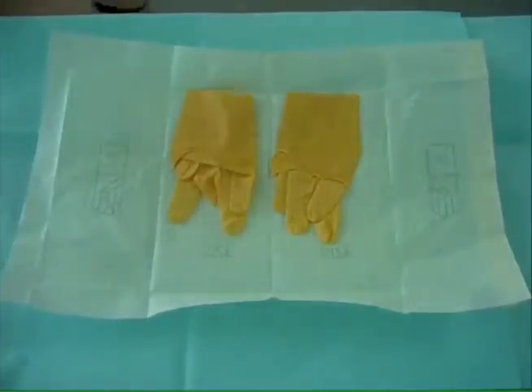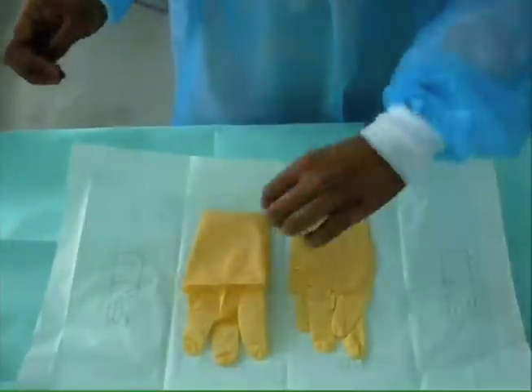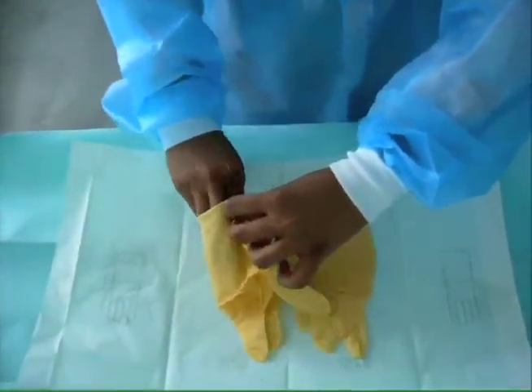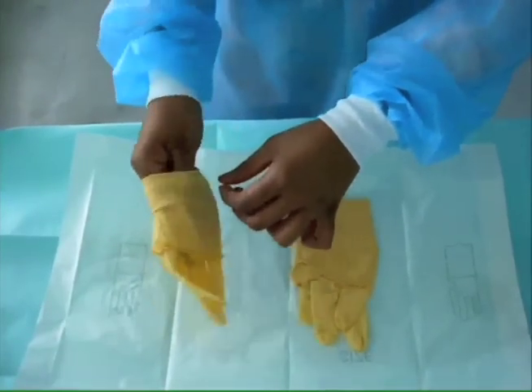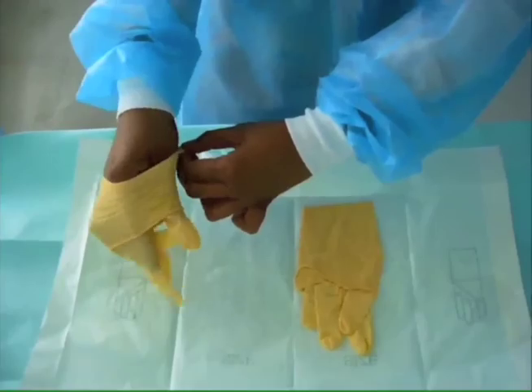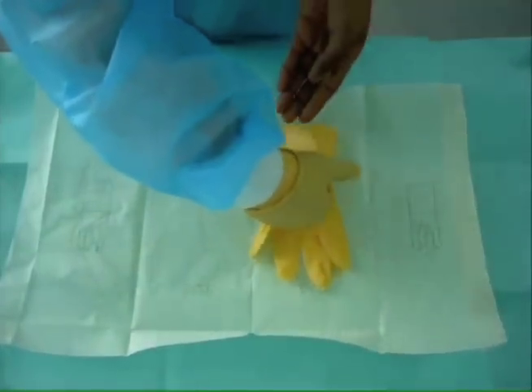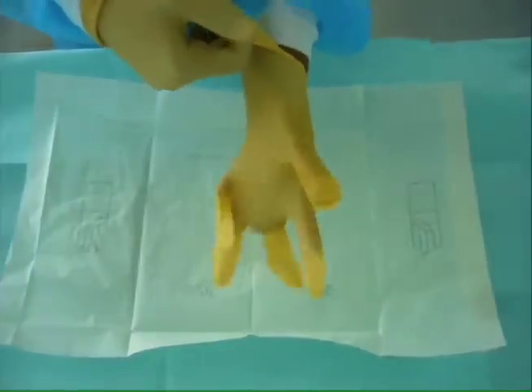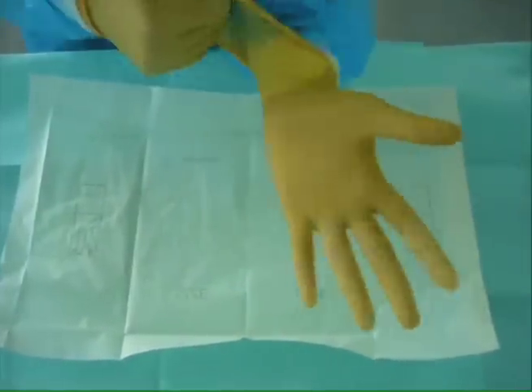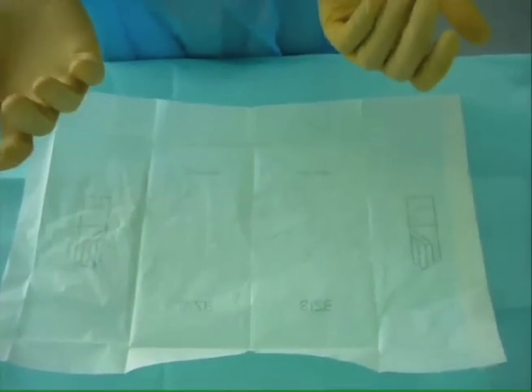Donning Sterile Gloves. Pick up one glove by the cuff using your thumb and index finger. Touching only the cuff, pull the glove onto one hand and anchor the cuff over your thumb. Slip your gloved fingers under the cuff of the other glove. Pull the glove over your fingers and hand using a stretching side-to-side motion. The cuff of the glove should be covering the knitted end of the gown.